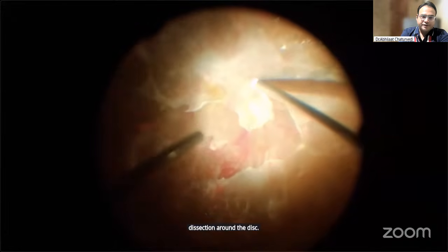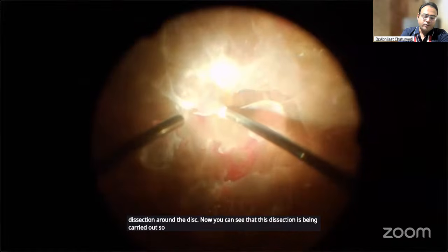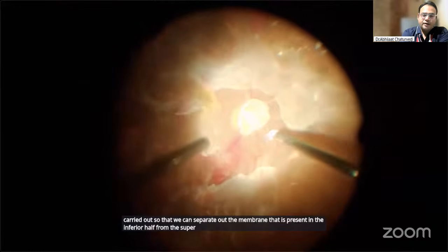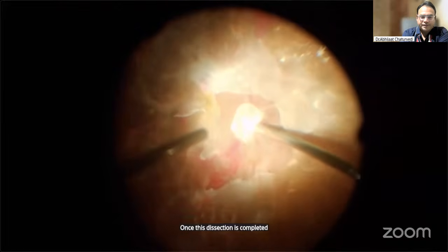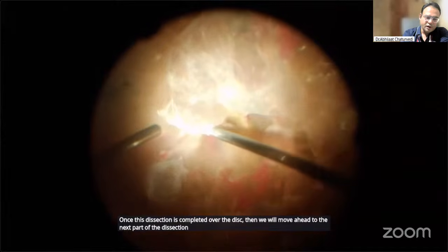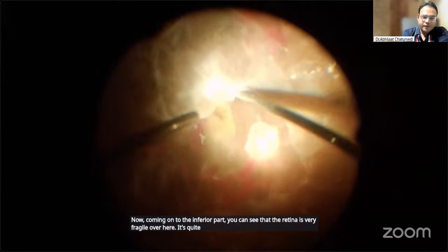Now you can see that this dissection is being carried out so that we can separate out the membrane that is present in the inferior half from the superior ones, and this slightly relaxes the retina a little bit. Once this dissection is completed over the disc, then we will move ahead to the next part of the dissection. Now, coming on to the inferior part, you can see that the retina is very fragile over here. It's quite ischemic as well.